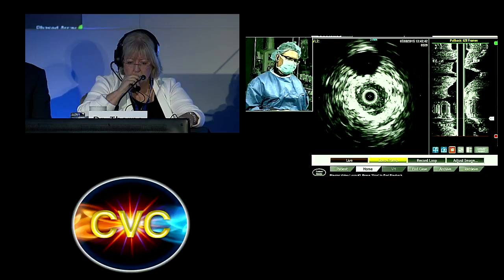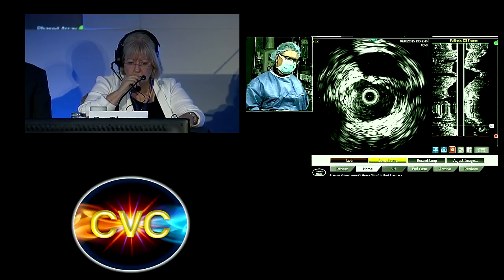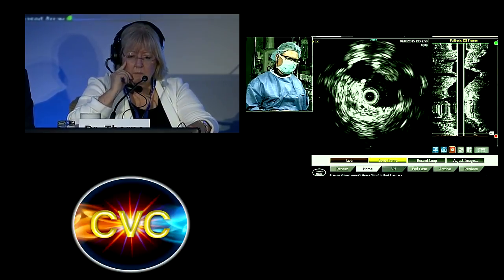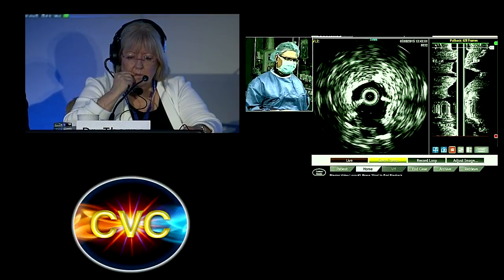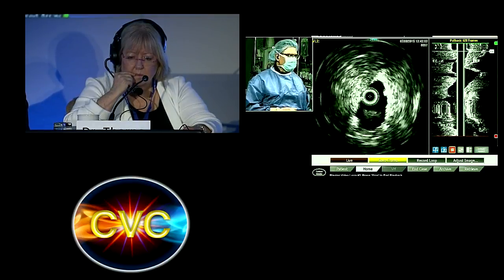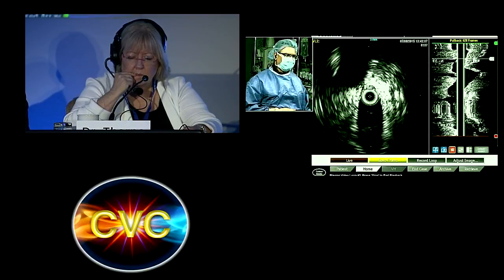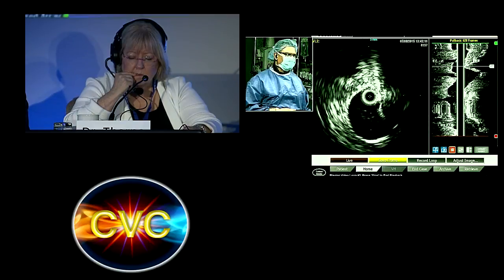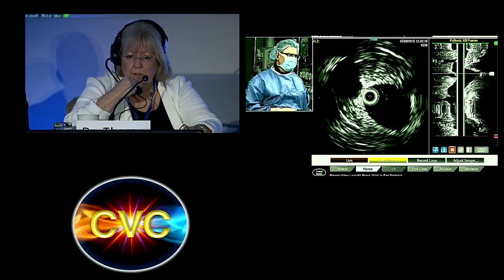It's almost completely blocked, very narrow, and then opens up to this big confluence of the superficial vein and the profunda. And this is then the superficial femoral vein. So we really are dealing with the stenosis right across the femoral vein, just exactly your presentation at that particular location. Do you think that that was from the filter placement?